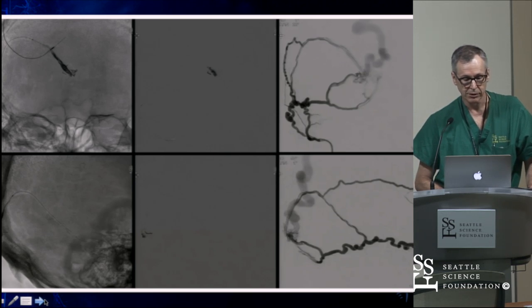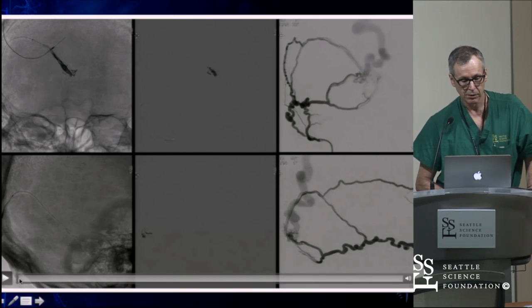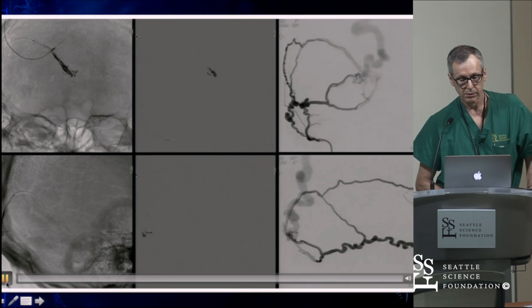And this is the Onyx injection here. It only goes on for about half an hour, so we probably won't play the whole thing. I'm just going to jump forward through it. You just have to be a little bit patient.